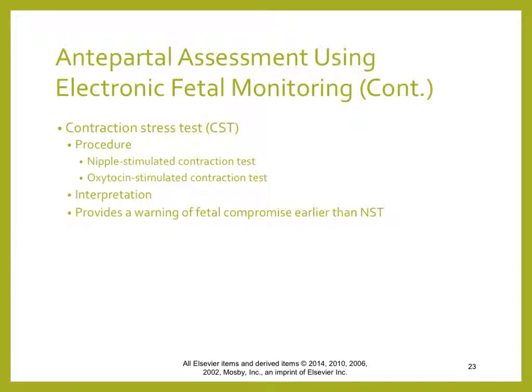Same thing, mom comes in, she's put in a semi-Fowler's sitting position with a lateral tilt. She is hooked to the same thing, the transducer and the toco, so we can obtain the same information. We're looking at information from mom and from baby.